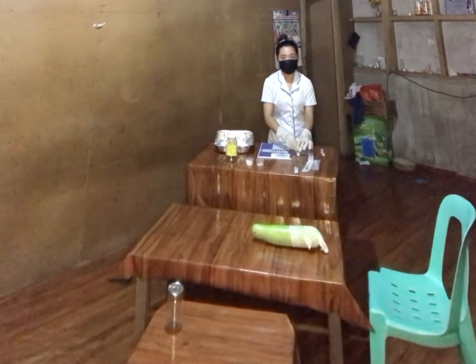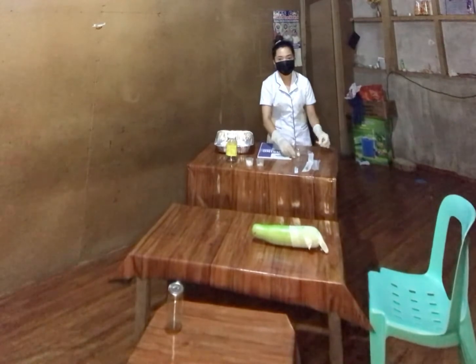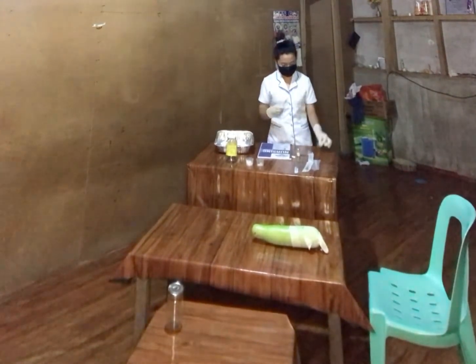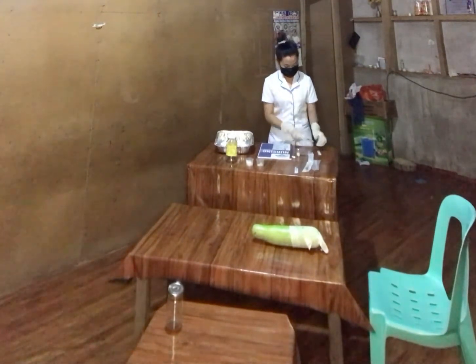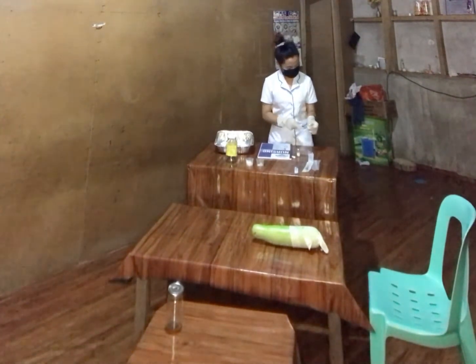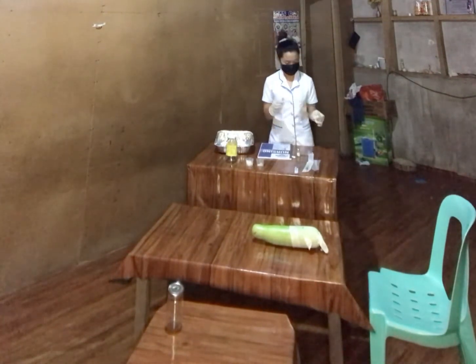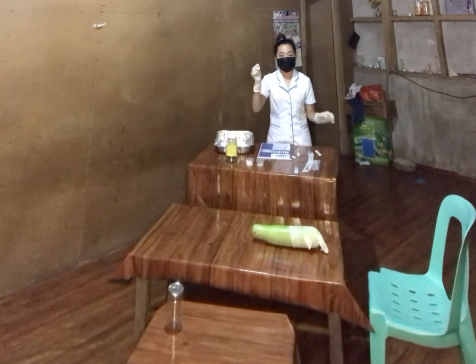So now take the syringe, uncap the syringe, and draw air into the syringe. After that, inject the air into the vial.